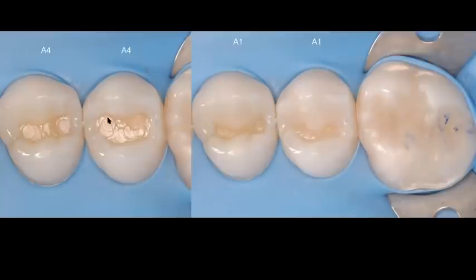So my first layer is going to be an A4. You can see I have condensed both of these horizontal layers. And the other thing that I want you to pay close attention to is that I am not at the cavosurface margin. I'm actually below the cavosurface margin. So I want to make sure that my dentin thickness, my A4 shade thickness, is always below that cavosurface margin, so that I can visually assess that there's room for my successive layers, which are going to be my oblique layers.